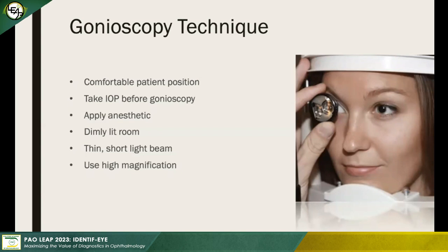Always take the IOP before gonioscopy, because gonioscopy changes the structures and the dynamics of your anterior chamber and might also affect your intraocular pressure. So before starting, apply your anesthetic.